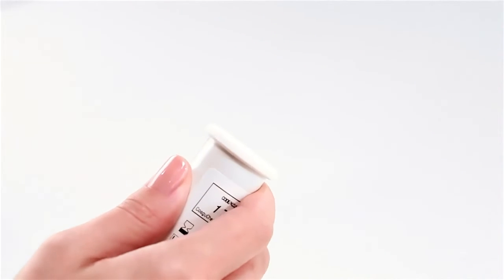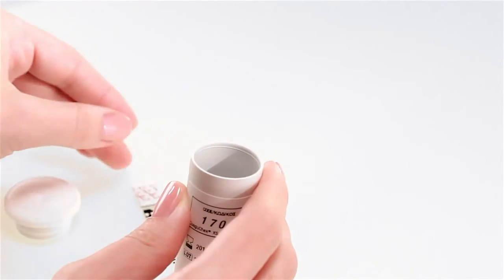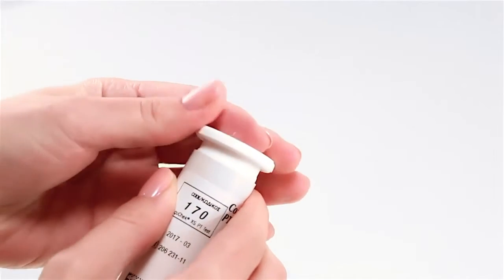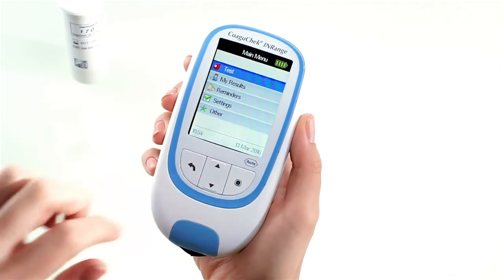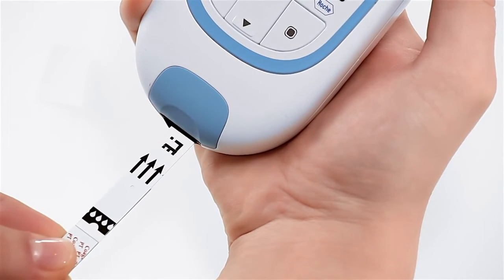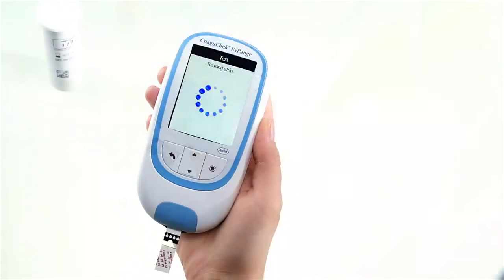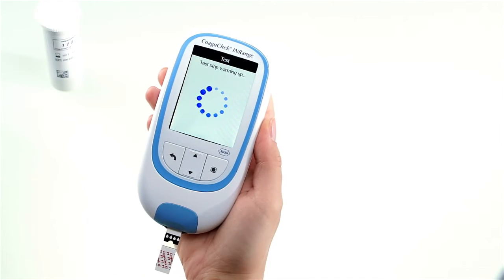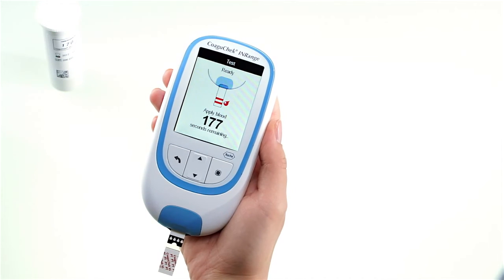Take a test strip from the container and always remember to immediately close it again with the stopper — this helps to protect the remaining strips. Hold the test strip so that the arrows are facing upwards and slide it into the test strip guide as far as it will go. Once the test strip and blood drop symbols appear on the screen, the meter is ready to test your blood sample. You now have 180 seconds to apply your blood to the test strip.